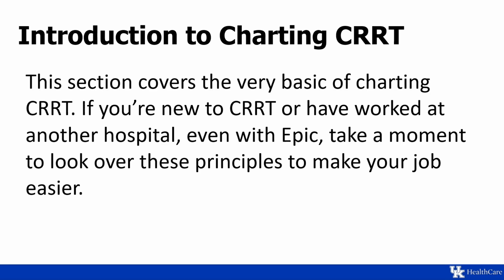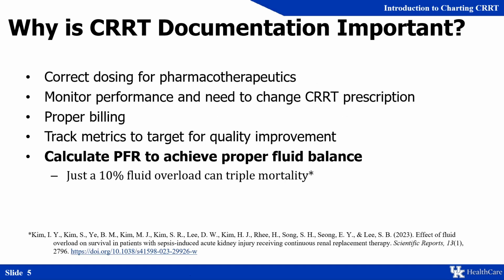This is pretty universal for pretty much anywhere you're going to be, but specifically for UK healthcare, we have some specific needs. You may wonder why CRRT documentation matters, and there's a variety of reasons. We need it to look at the correct dosing for pharmacotherapeutics, because different types of clearance will have different ways of changing your pharmacokinetics, and the charting will illustrate which one you're currently on. It will help the nephrology team monitor the performance of their prescription and whether they need to increase or decrease your effluent dose or move it from more convection to more diffusion based.